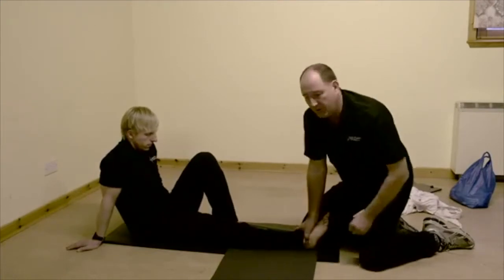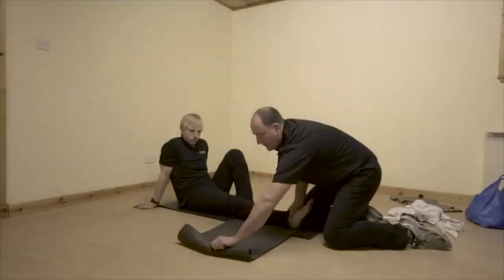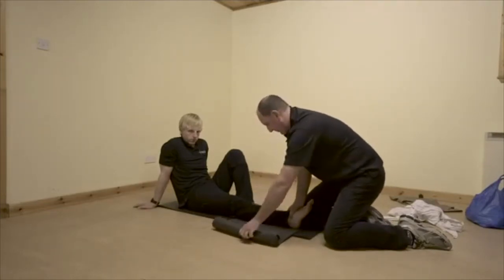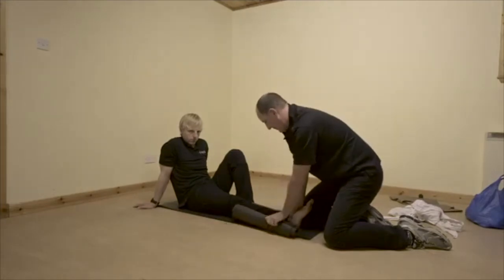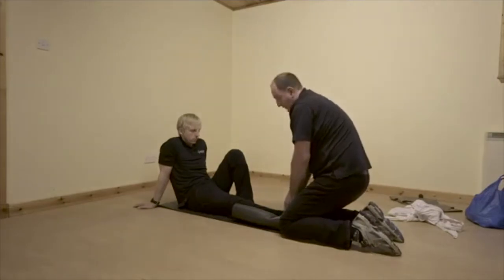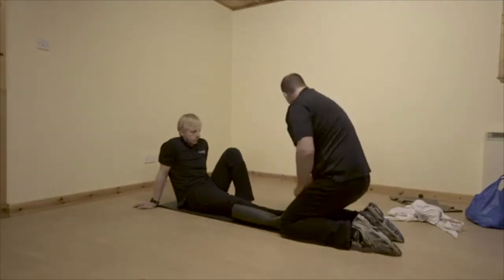I'm not going to let go of his foot because clearly his leg will fall out. And then we're just going to do the same on the side - roll it up nice and firmly as tight as we can. Bring that right up to the casualty's leg, and again I can use my knees to keep that nice and secure, and that stops the leg from moving.